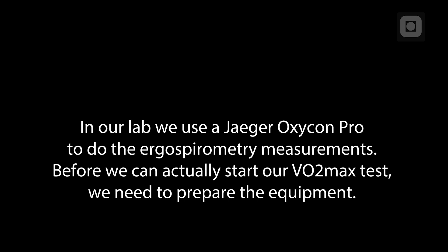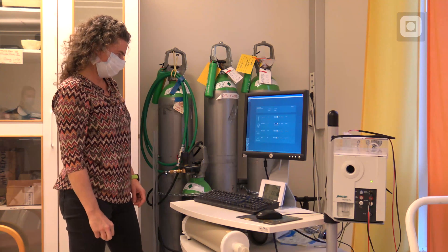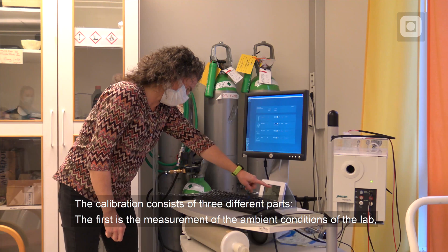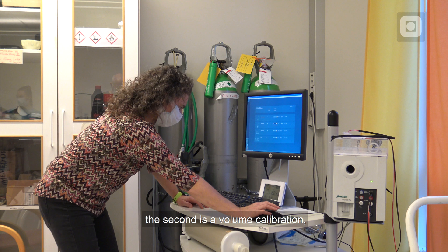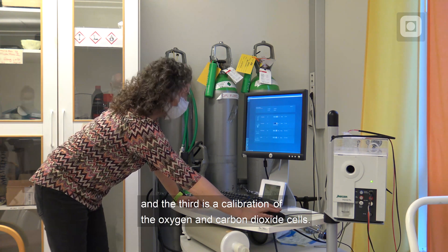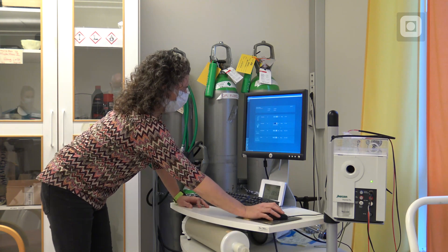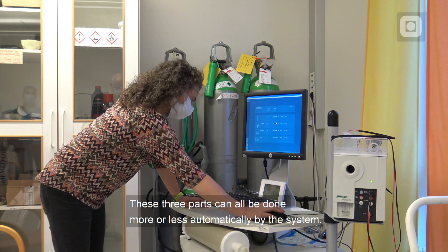Before we can actually start our VO2Max test, we need to prepare the equipment. The Jaeger equipment has to be switched on at least 30 minutes before the measurement and we need to perform a calibration of the system. The calibration consists of three different parts: the first is the measurement of the ambient conditions of the lab, the second is a volume calibration, and the third is a calibration of the oxygen and carbon dioxide cells.